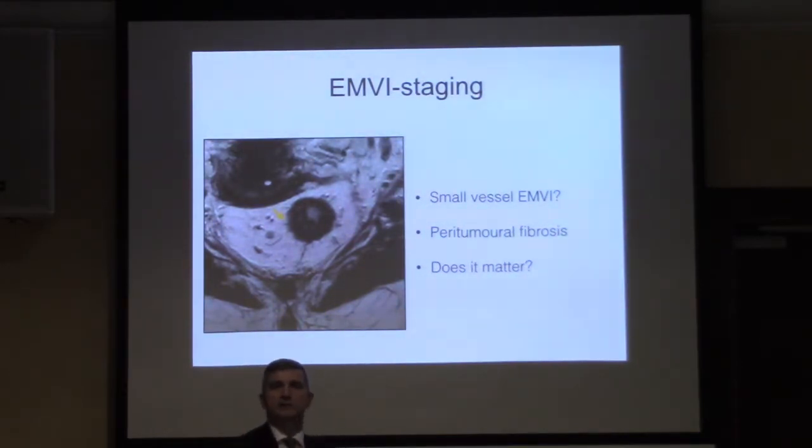They get treated like T2 tumours. So actually, you can make the observation, but if it's limited, as this one is, to a short distance, it doesn't change the outcome. It doesn't imply anything else. So I think you should try and say, I think it's just peritumoral fibrosis, because that's what it is. But actually, if you're wrong, when it's limited like that, it doesn't make any difference to the outcome, because they'll still get treated the same. That patient would, if they didn't have any other features, just go straight to surgery.